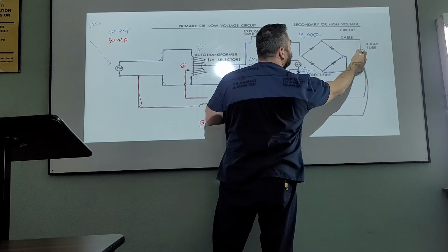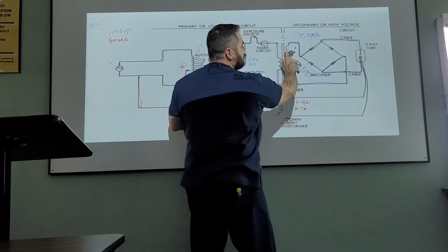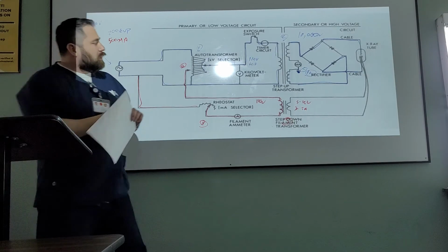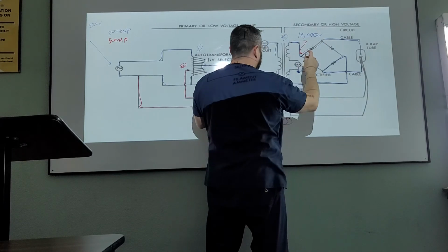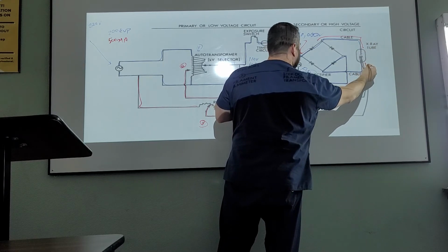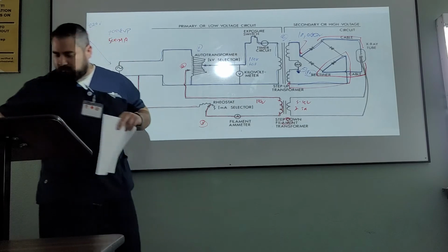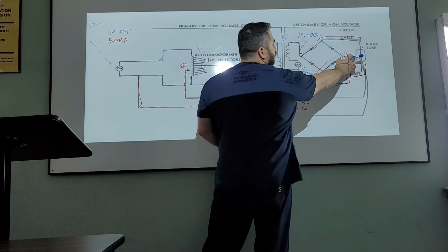This is our X-ray tube. Come up. Here, there's one part of the circuit. Now, if it's coming from the top, I'm going to grab a different one here for you. It's going to come down this way, following the line just the opposite way here, back to our X-ray tube, and then completing that circuit there. So from that point, we've got this coming in at the anode point of the tube.